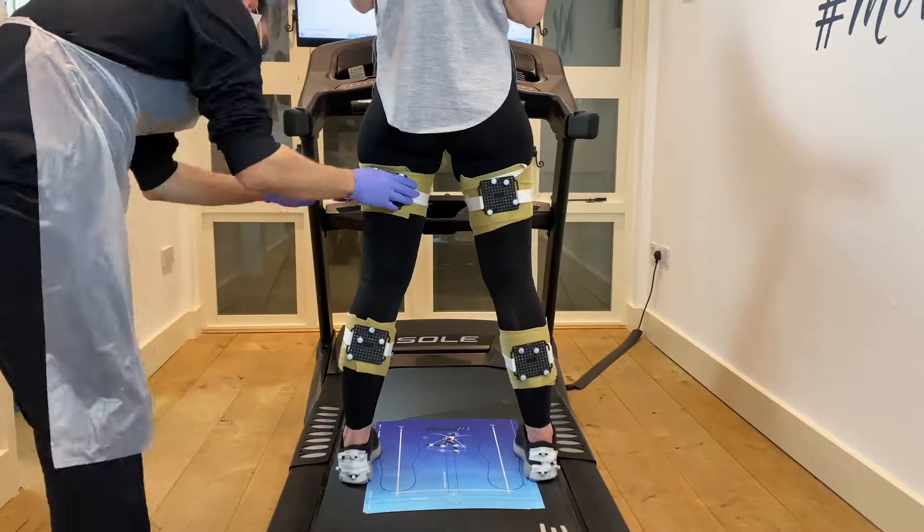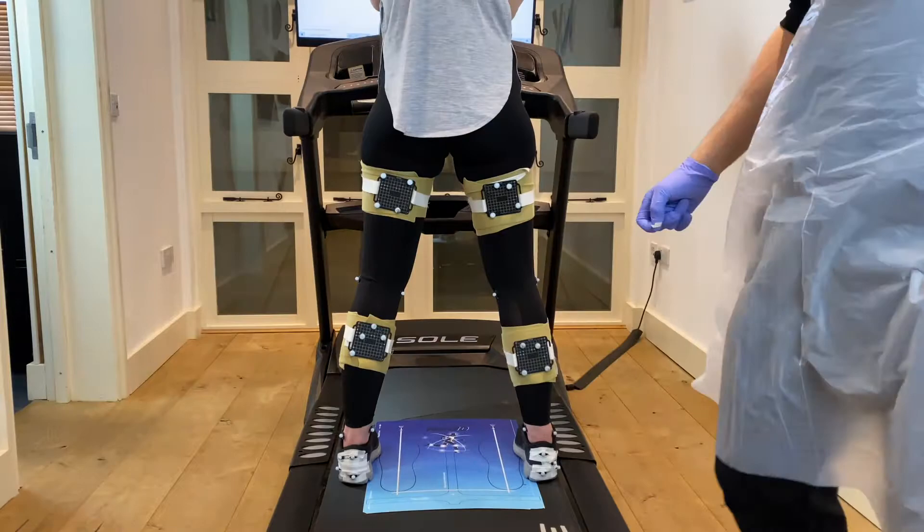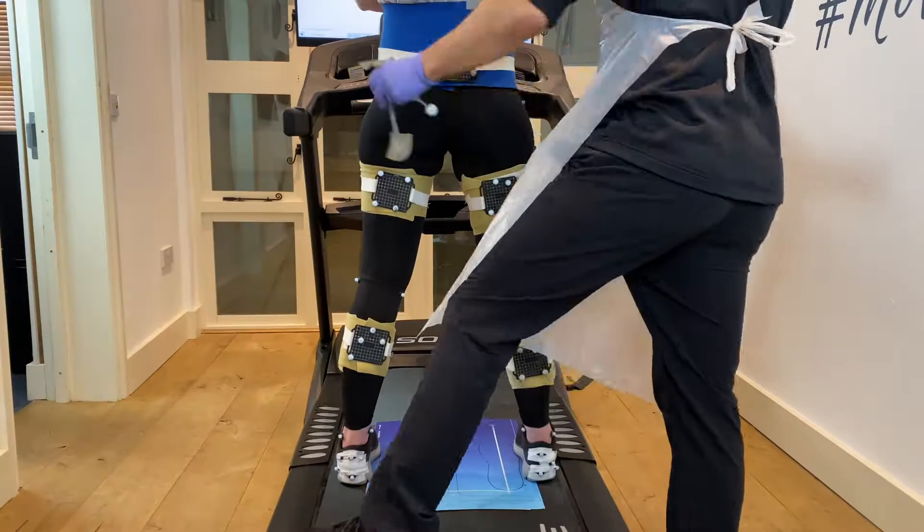This is the same technology used in films like Planet of the Apes and video games like FIFA or Tony Hawk. By doing this it allows us to build the relationship between the lower limb — the hip, knee, and ankle.